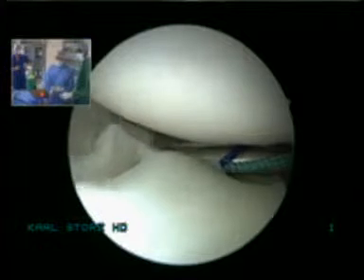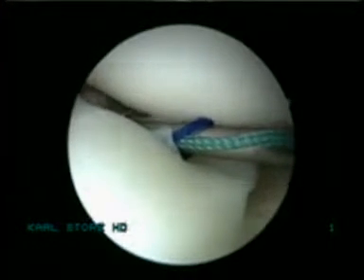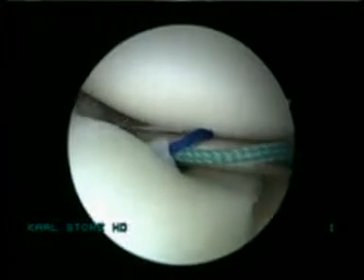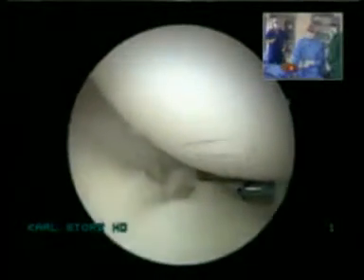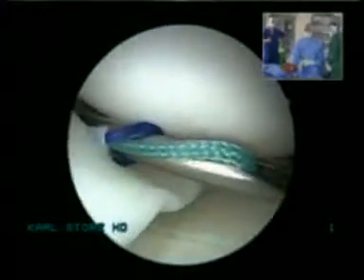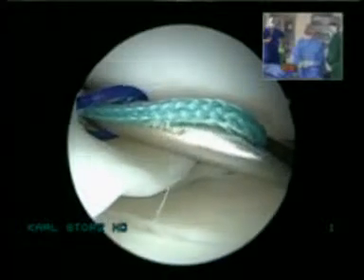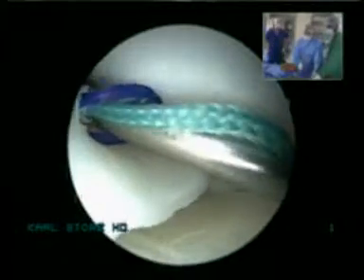And on the medial side, the ACL was absent. He has a 3+ Lachman test and double plus pivot shift, was highly unstable, and he has a bucket handle tear on the medial side. I have already applied a fast fix to the posterior horn, and now I continue with the outside-in sutures in the anterior horn. Okay, so you've done a fast fix repair of the posterior horn of the medial meniscus.